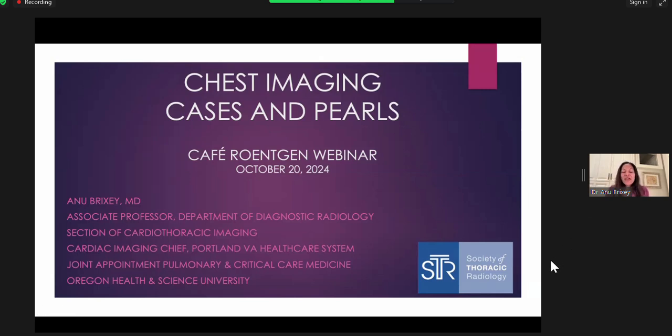Absolutely. So I'm going to give this talk, chest imaging cases and pearls. I like this presentation style in terms of cases because I think it can help the viewers remember a lot of these cases, as opposed to just telling you facts about different things. I have 6 cases in here. They're cases that I think are good to talk about because they're things that you may not think about very often, but they have a very large impact on the patients that you're seeing. So that's why I chose these 6 specific cases.